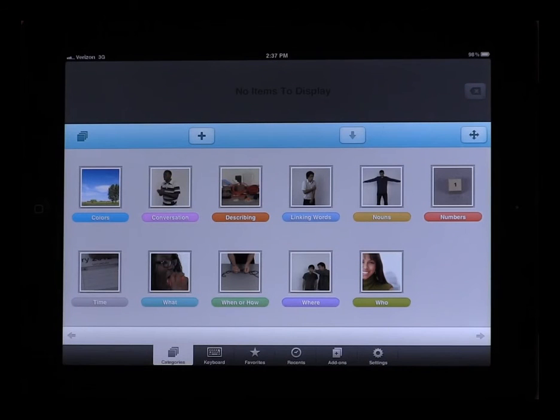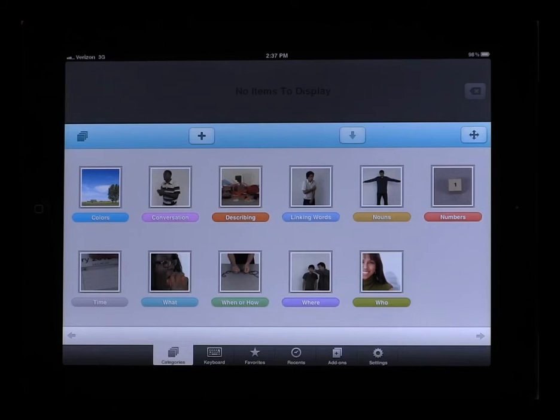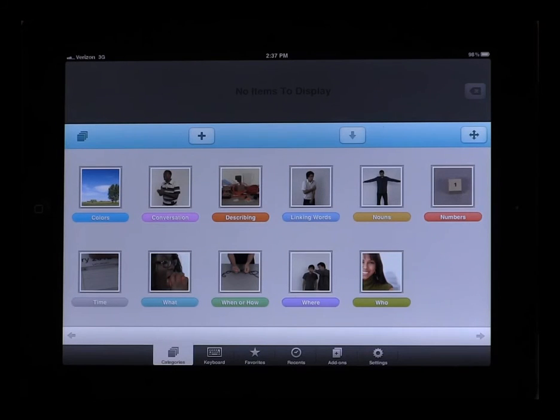The Recents tab allows you to see the last several sentences or phrases that you have spoken using the Functional Communication System. It's basically like a history menu in your web browser.